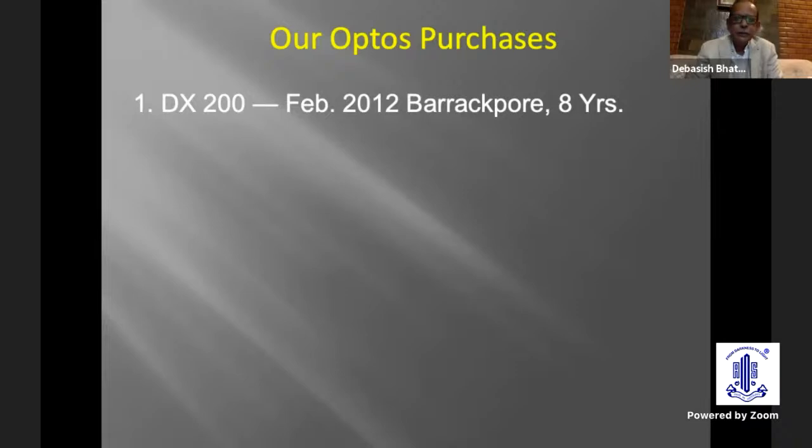Telling our experience of DX200, which can also do angiography, there's something called a polygon. We have changed it thrice. It costs us, with the person who comes from outside, from China, people used to come, and it costed us $6,000. We did it 3 times. That was the entire maintenance on this equipment. It's still functioning. We do our angiographies, peripheral angiographies with this machine.